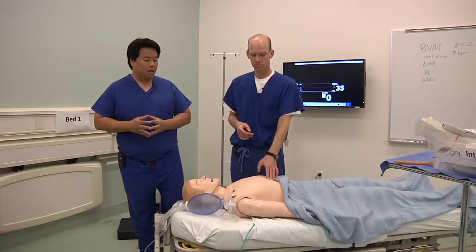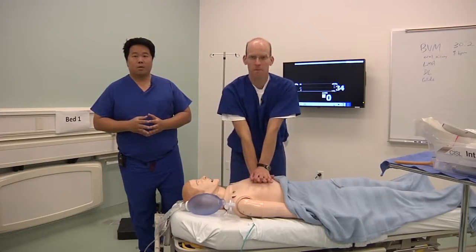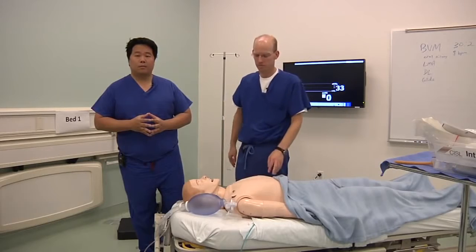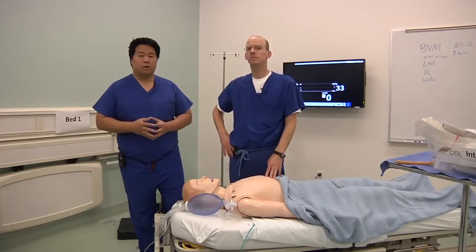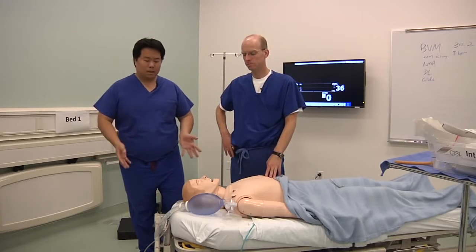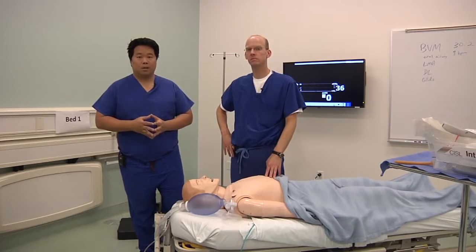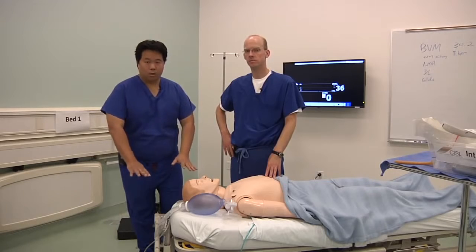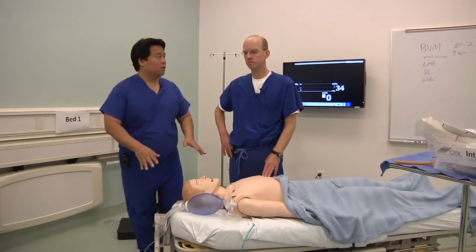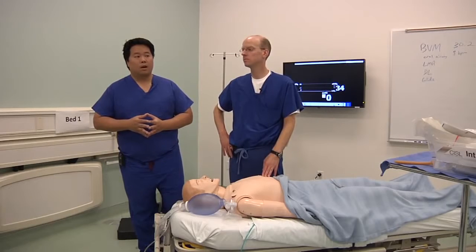This is so that you can aid the compressor. If you want to demonstrate, Kyle, how the bed position is now much more optimal for the compressor, providing compressions for resuscitation. However, that comes at the expense of the person managing the airway, because they're now much lower to the floor. The patient's not necessarily in the sniffing position, not necessarily towards the head of the bed.